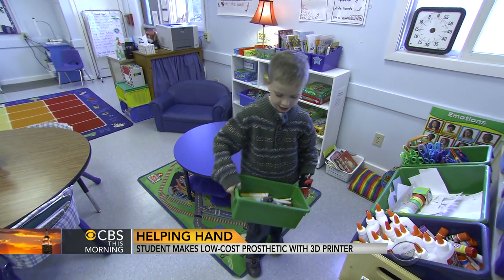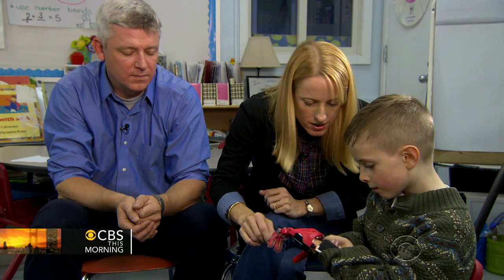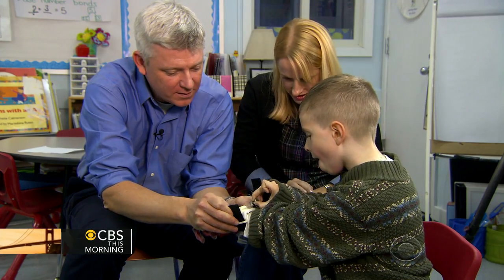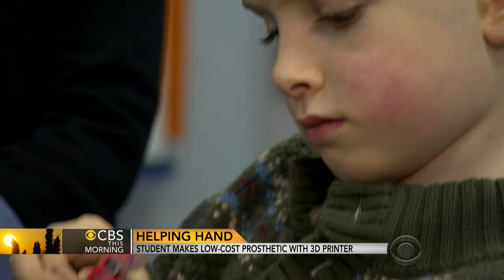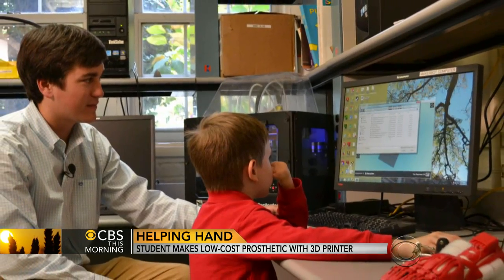I don't want him to be limited by the condition that he was born with. So this isn't just about a hand for him — it's about enabling him to do anything that he wants to do. Holden's parents believe the impact could be even more profound. He was less likely to be underestimated when he has a device like that. People won't look at him and say, oh, you can't do that. There are times when he doesn't necessarily like kids to ask him about his hand. But because the 3D printed hand is so cool, I think that gives him confidence in talking about his hand, which I love.